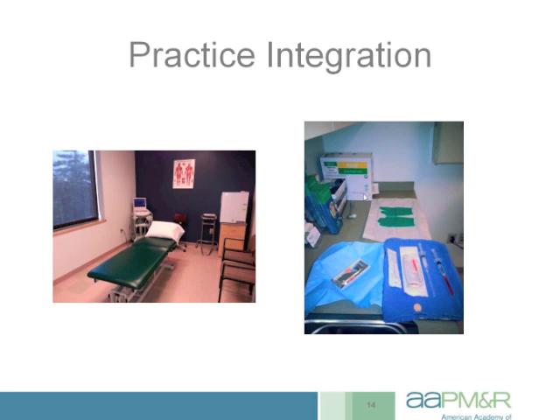As we talk a little bit more about practice integration and efficiency, this is showing the other side of the room that you can't see in this picture, and this is our countertop here, holding sterile gloves. Above it is cabinets holding all of our needles, probe covers, extra gel, all the things that we might need before and during a procedure. And usually when I enter the room, particularly if we already know what the patient's coming in for, my medical assistant already has things drawn up and laid out, which helps keep things moving along in clinic so we don't get behind schedule. We'll talk a little bit more about that in a few slides.